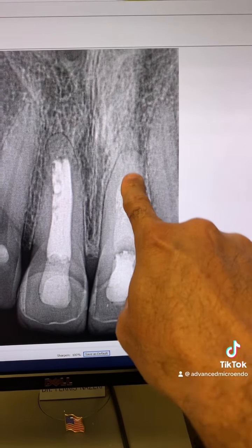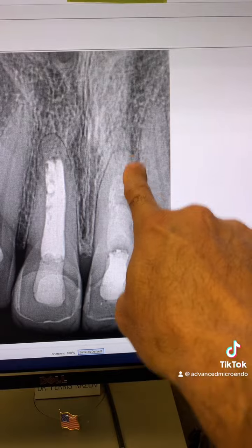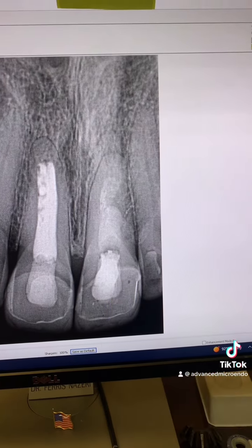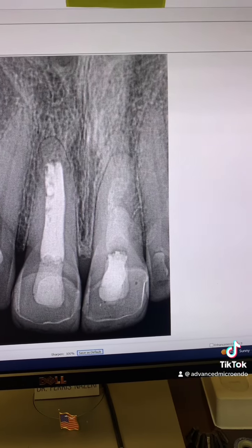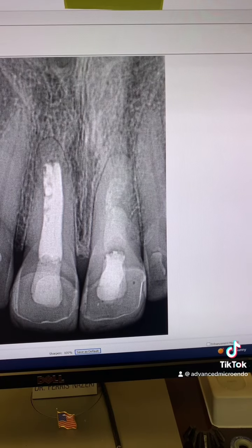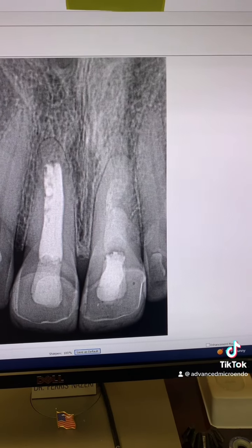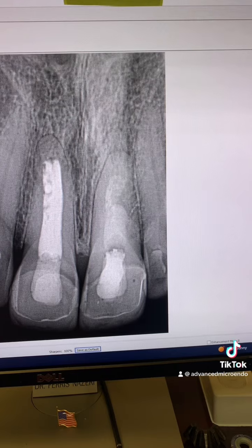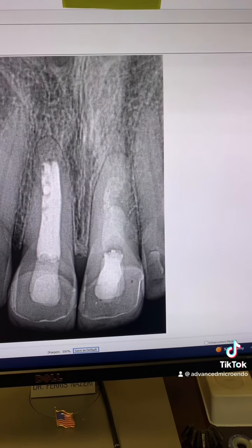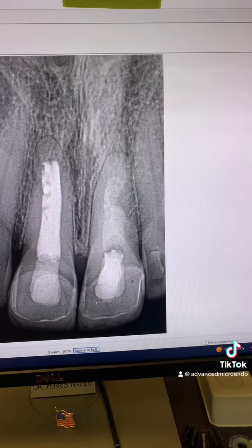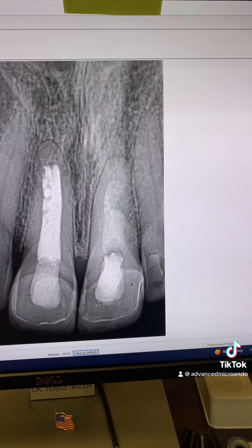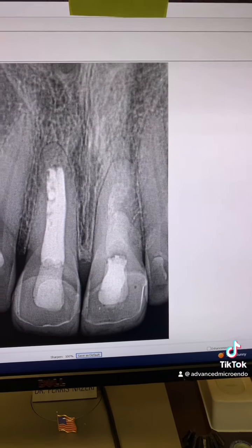Then we went ahead and obturated the entire canal with MTA. This is white MTA all the way to here. We went ahead and temporized the tooth and referred the patient back to our dentist. Hopefully that labial sinus tract will go away, but again, only time will tell — no promises or guarantees. The patient is supposed to come back in a few months for a post-op, and hopefully she'll show up. Then I will post a video on the outcome of the treatment.